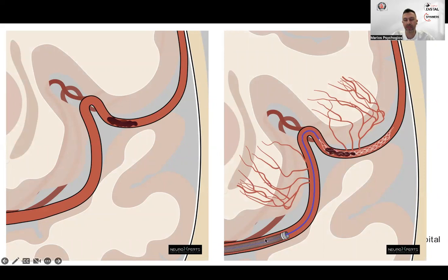This is the microcatheter that we're going to remove to introduce the small aspiration catheter. Or if you take the short 3MAX, then you can use it and go all the way to the clot and then remove the microcatheter to be able to have more aspiration volume within the 3MAX.